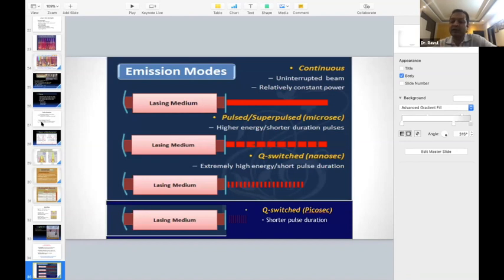Now, why I'm telling you here is the Q-switch is very important if you want to use it for post-sclerotherapy pigmentation. You can use this technology because you get this pigmentation there. You can use a picosecond or nanosecond Nd:YAG 1064 laser to take these pigments out.